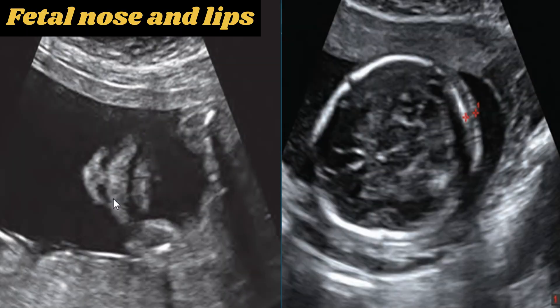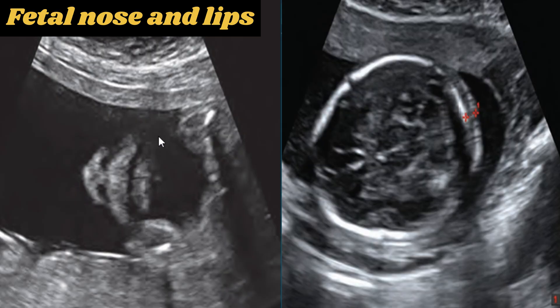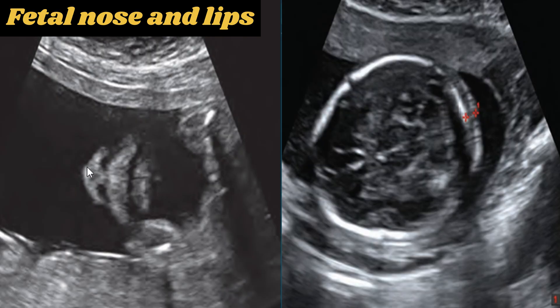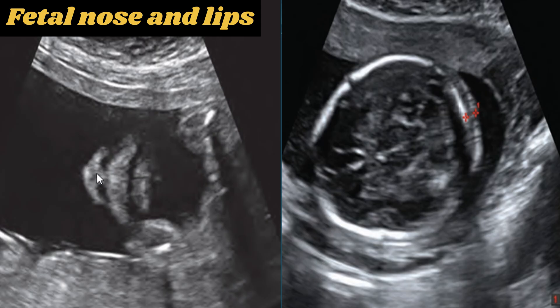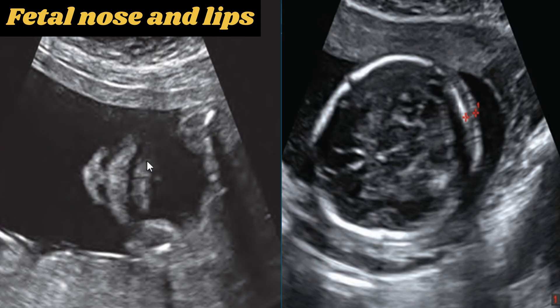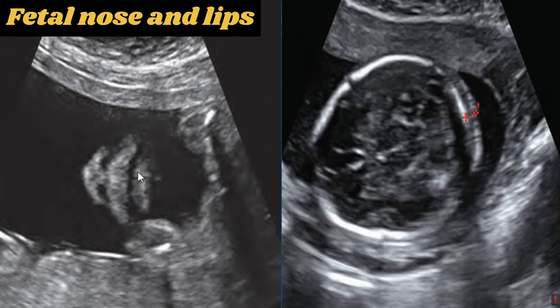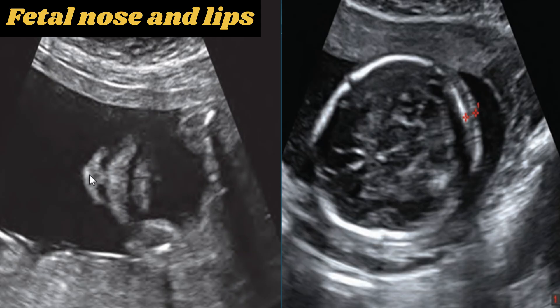Now we are going to discuss the nose and lips of the fetus at about 23 weeks gestation. In this coronal view, we can see the upper lip and lower lip showing a normal appearance with no evidence of facial cleft.